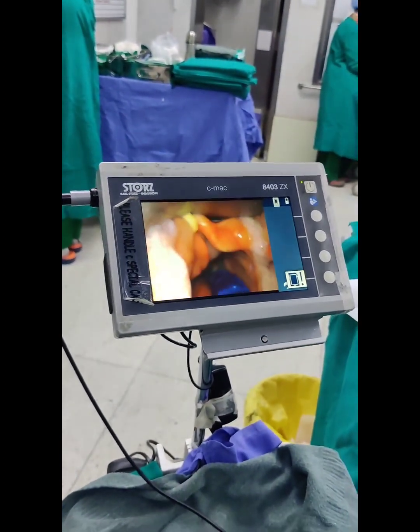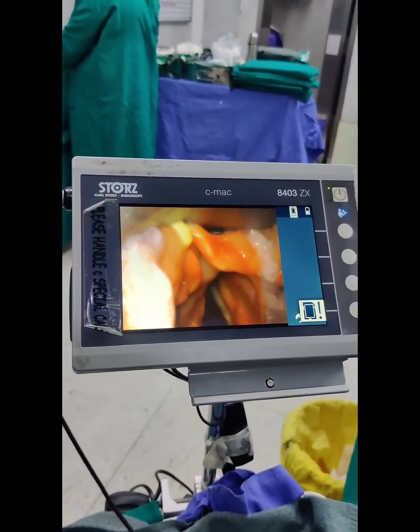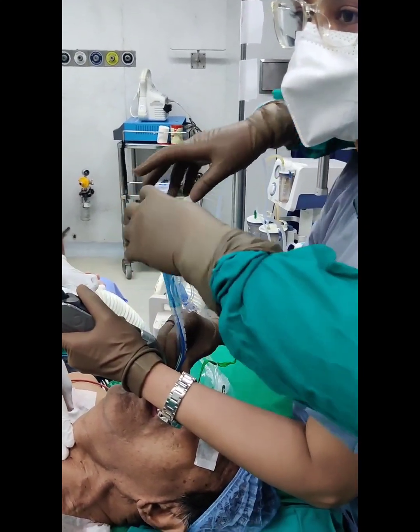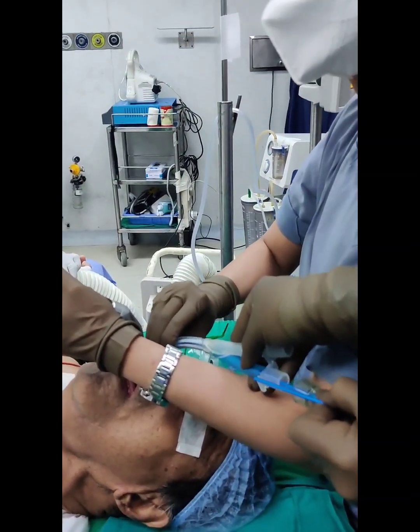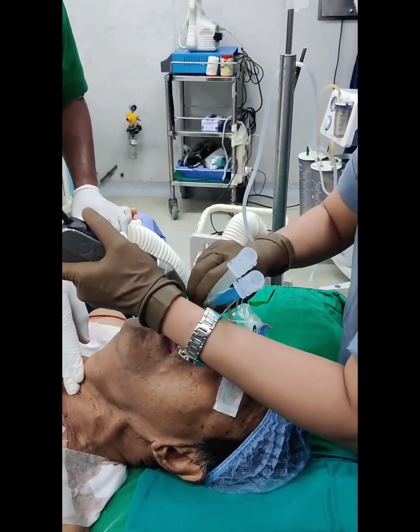Once the bronchial cuff is beyond the vocal cords, the stillet is gradually withdrawn. The tube is then rotated 90 degrees to the left for a left DLT, or 90 degrees to the right for a right DLT. The tube is then gradually advanced while the stillet is simultaneously and completely withdrawn out, and further advanced until it meets resistance.